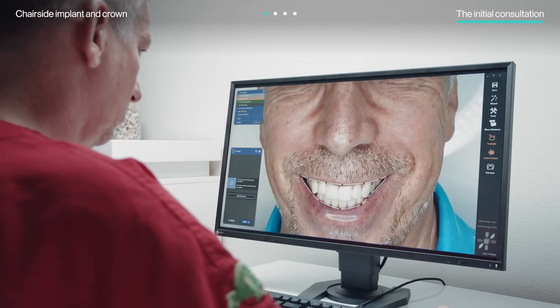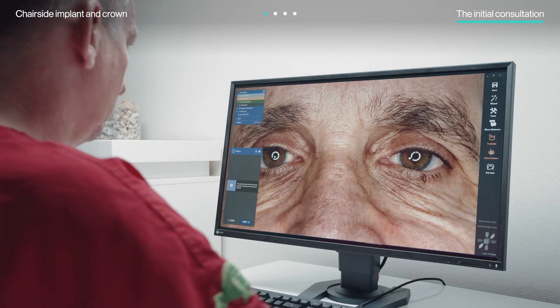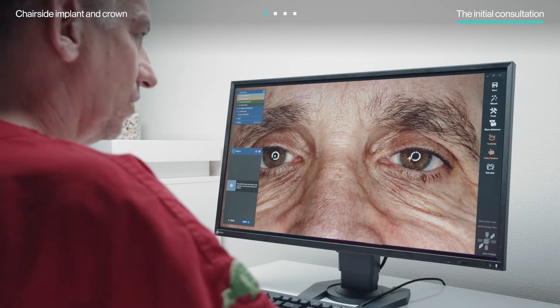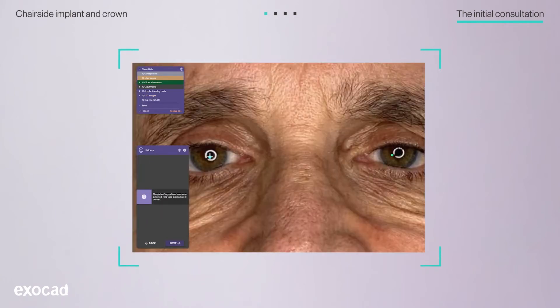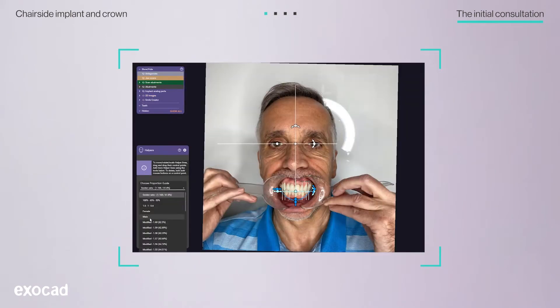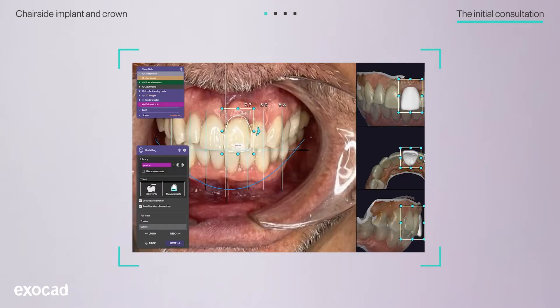Then, thanks to the iTero scanner's open system, he was able to begin working on the project with ExoCAD Chairside CAD software within a few seconds. The ExoCAD Smile Creator's innovative 2D/3D technology empowers doctors to reliably create prosthetically feasible aesthetic designs and share digital mock-ups of potential new smiles.